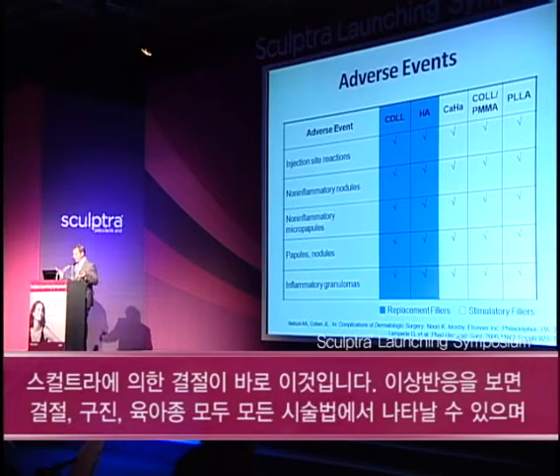So, in all honesty, adverse events, whether it's nodules, inflammation, papules, granulomas, if you look in literature, all the products have them. And often it is caused through technical issues. Wrong level of injection, wrong amounts, wrong reconstitution or whatever. And that's why it's so important that we understand our products and learn how to use them. Because nowadays, with a variety of products, you can't say if you know how to inject Restylane, that you also know how to inject Juvederm or Voluma or Sculptra. No, they all are different, and they all are a little bit different to inject, and you have to get the experience to get the outcomes.